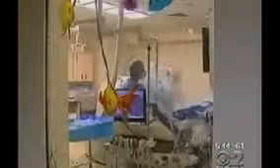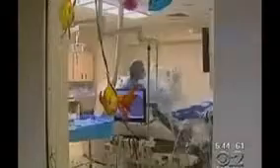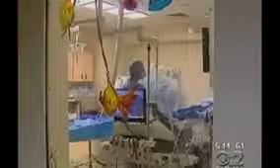Shasi's problem was potentially lethal, so she ended up here in the cardiac electrophysiology lab at Valley Hospital in Ridgewood, New Jersey. The standard procedure is to make an electrical map of the heart to find where the abnormality or short circuit is coming from. Then we put in a burn or cautery type of burn from the tip of the catheter to interrupt that circuit. The placement of that burn has to be exact. Hard to do when you're steering a tiny tip at the end of a 3-foot-long catheter.